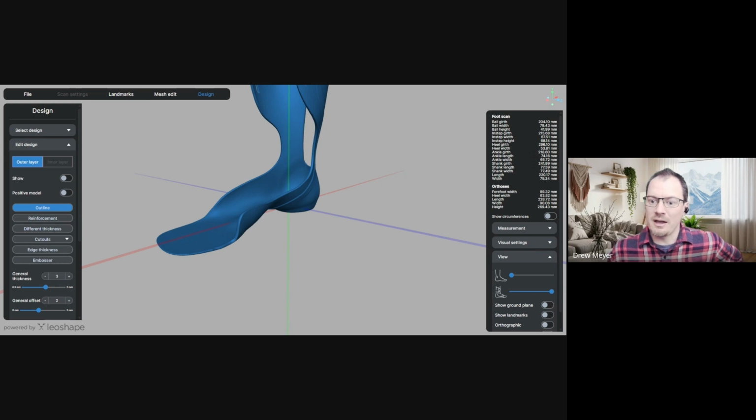First question is, can you add different orthotic joints to the scan? Right now, what we have built into the system is small, medium, so the pediatric, the medium, and the large Tamarack joints. Those are the ones that are built in by default. I'd be curious, Harsh, if you could add which other joints would be important to you, because we've had lots of requests for a variety of joints. There's so many joints on the market. The question is really, which ones make the most sense for 3D printing? So I'd be curious to know what joints you're looking to use there.